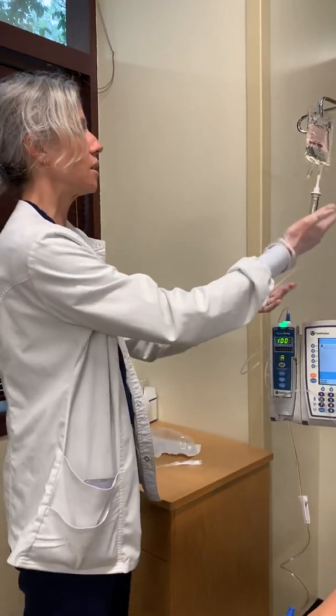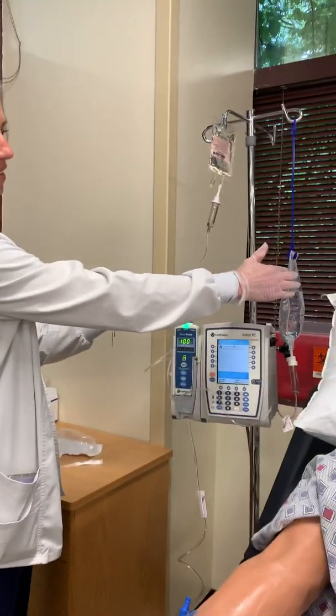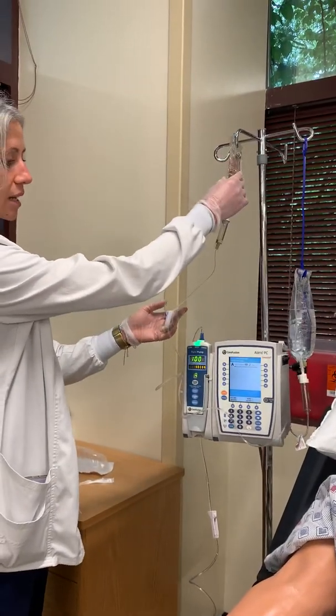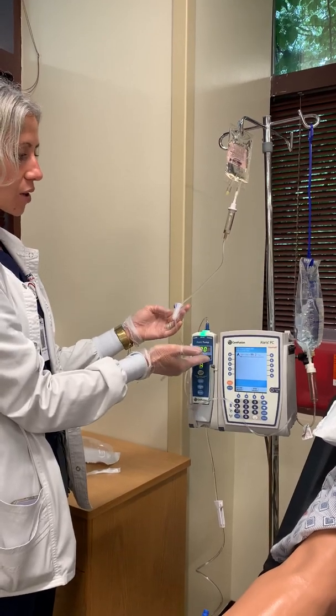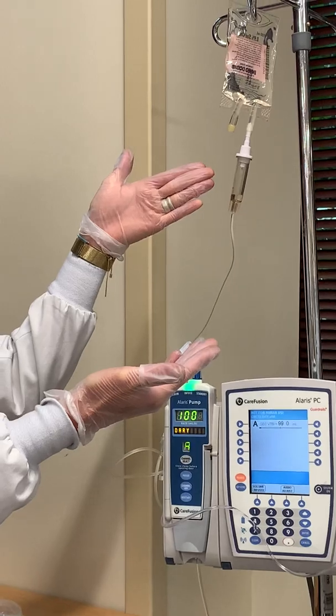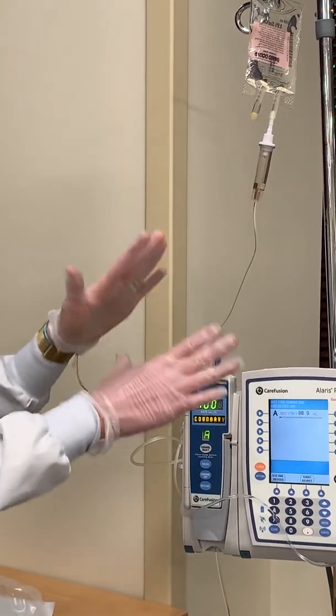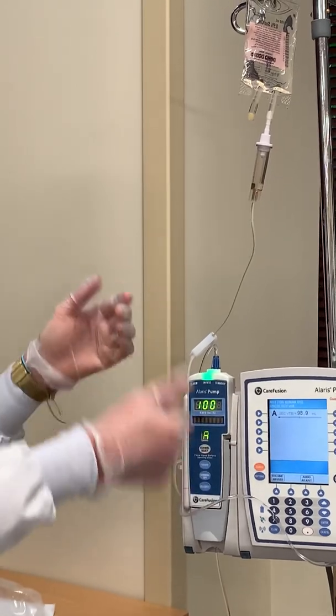So in this case, I see that I've now switched over from my primary. It's now running my secondary, okay? And it says that, right? So I've got 100 mils, but don't just trust that. What do we want to trust? Okay? Always look at the bag, okay? Don't just rely on this machine. We turn into little robots and we just look at this and we forget, okay?